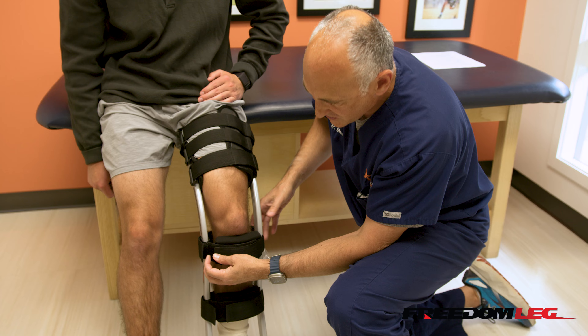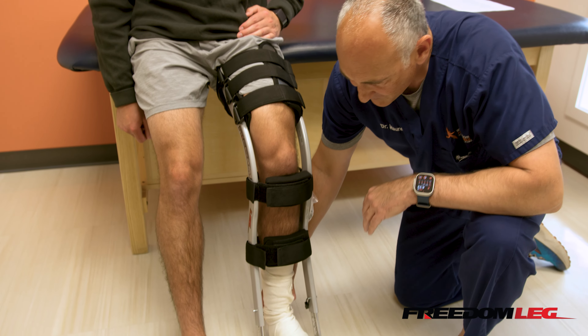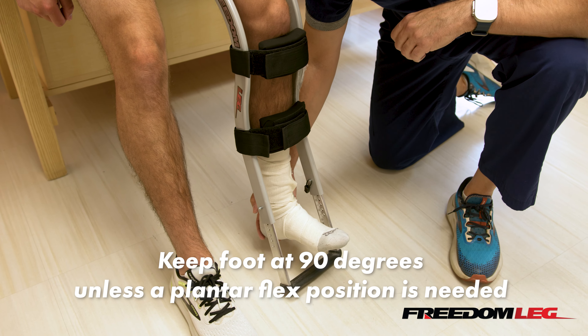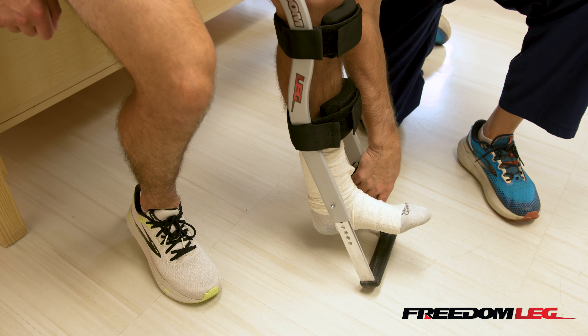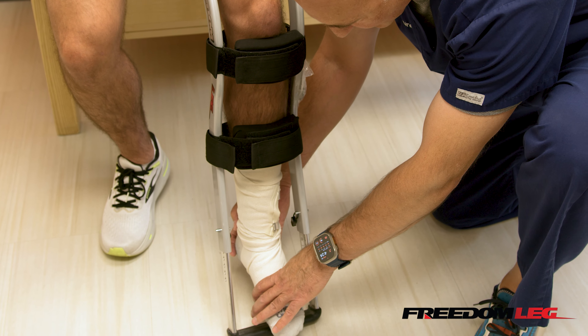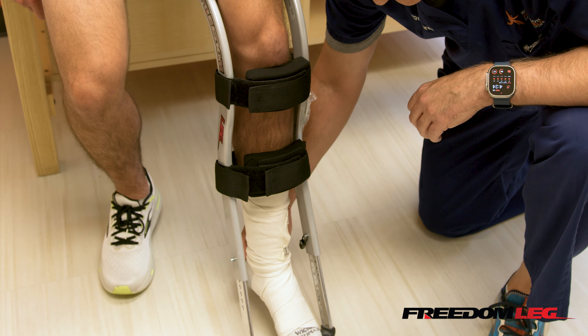The other thing you want to pay attention to at this point is keep your ankle at 90 degrees. After surgery, you'll be in a boot, a splint, or a cast, and your foot will be at 90 degrees — so you want to put it at 90 degrees so that you can assess the length properly. If you're having Achilles surgery or surgery on the muscles or tendons to the back of the ankle, you may be in a plantar flex position, and you need to account for that.